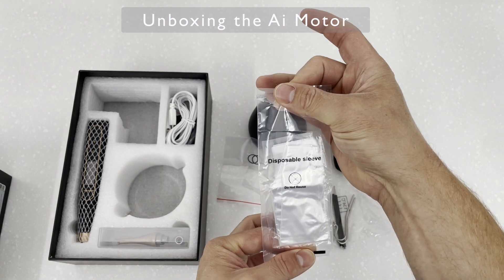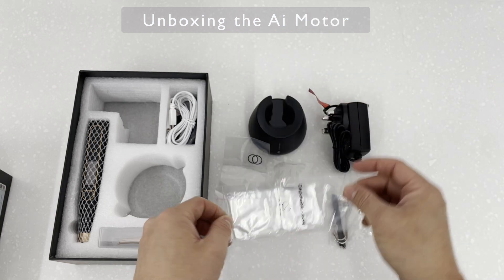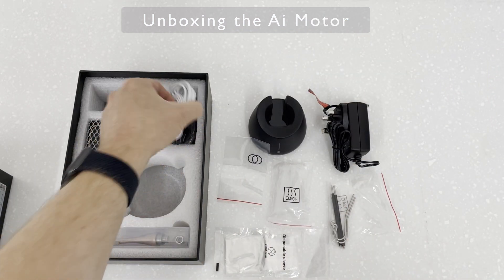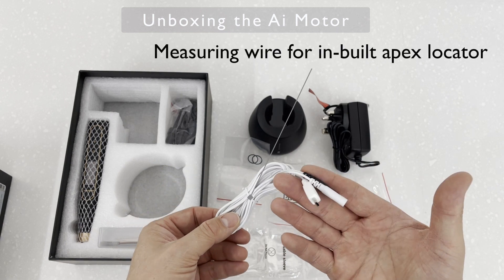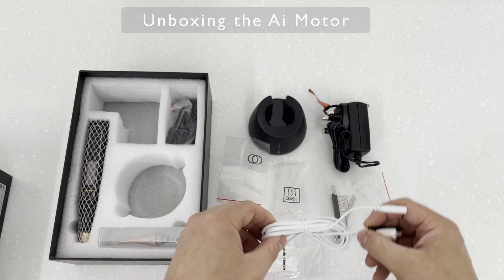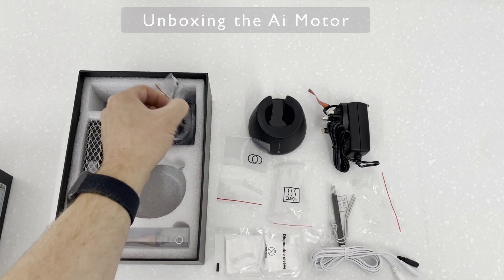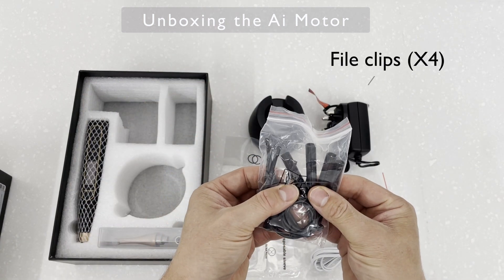There are some disposable handpiece sleeves and a measuring wire for the Apex Locator. You also get four file clips, which is quite excessive but definitely worthwhile.